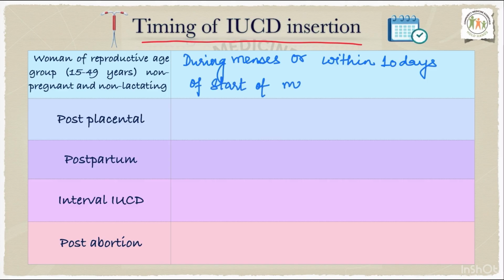Post-placental insertion can be done within 10 minutes of delivery.